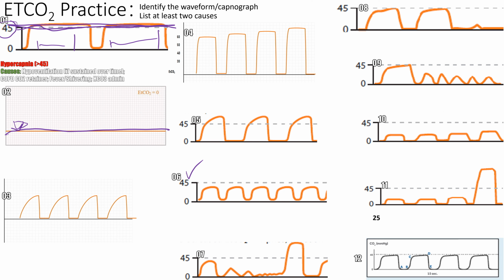All right. They could be post-ROSC, or not post-ROSC but pre-ROSC, right? So they had no return of spontaneous circulation, so they're dead. Or it could be apnea testing. When we do apnea testing for brain death, this would be a positive brain death sign: there was no ventilation. There was no signal sent down from the brain to the lungs to breathe because the brain is dead.